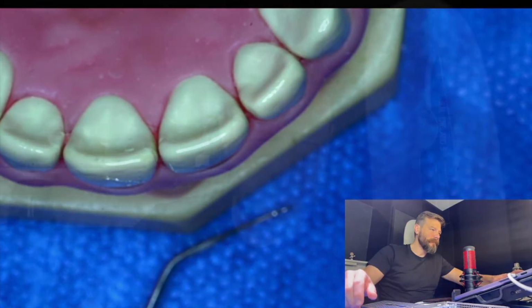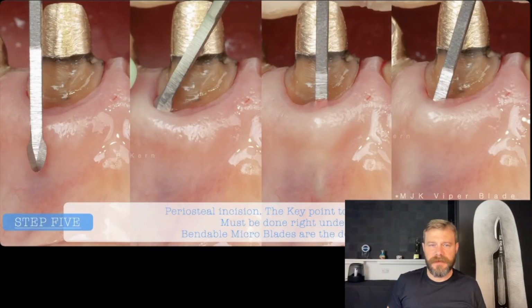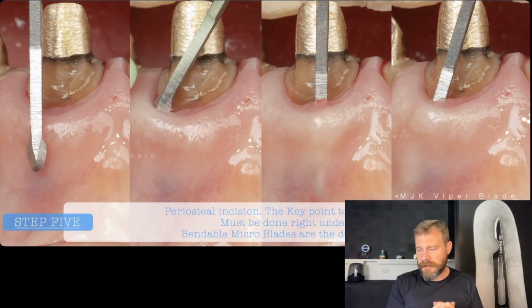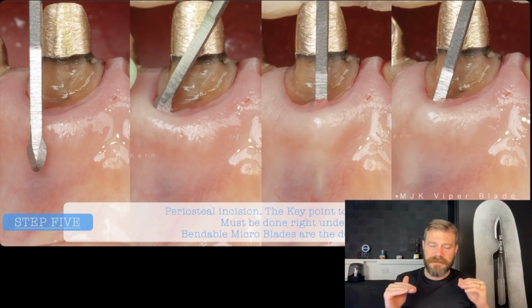Okay, so let's move once more. We know how to use this instrument. We have detached all the attached gingiva until the mucogingival line. Now is the step where I'm going to need to promote a releasing of this tissue. And I really believe that from this step on, the releasing of the flap is cleaner when you do that with a microblade.